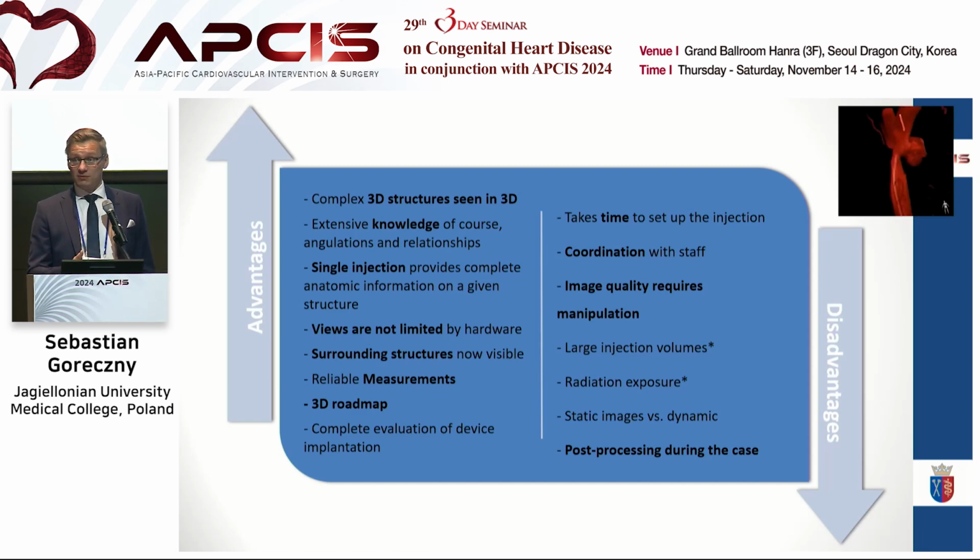There are many benefits, but one of the significant limitations is that you have to do that post-processing when the patient is on the table. So think about it. You do your angiographies the usual way. What next? You want to have measurements, and then you tell your nurse what balloon or stent you want to use, okay?